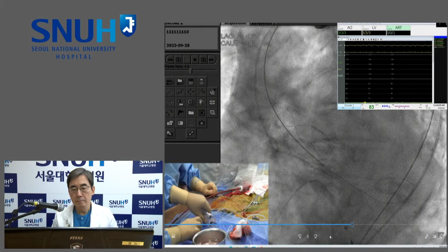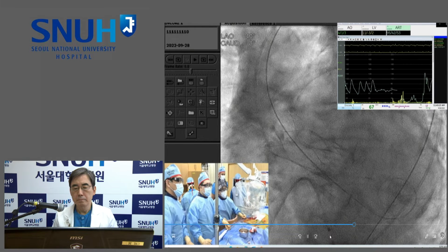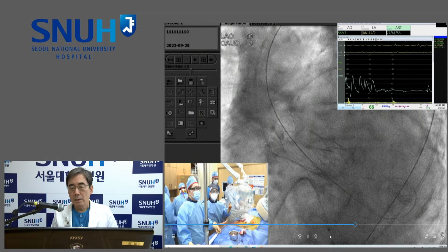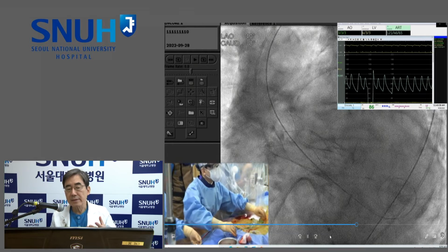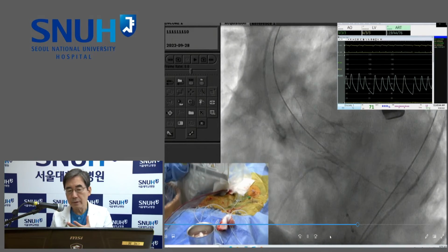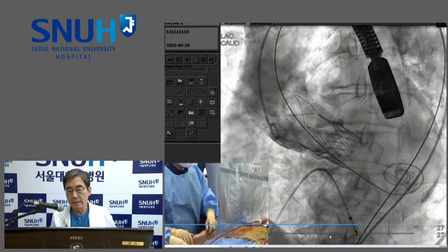The stabilization of the upper part of Accurate Neo, what does it mean? You mean the tight contact between the upper part of Accurate Neo and the ascending aorta? Yeah, the stabilization arch may contact the whole ascending aorta if the ascending aorta size is not big enough. But in this case, the ascending aorta size is big. Thus, on the left side the arch contacts the wall, on the right side no contact. But still, it is very helpful to stabilize the whole system's position.